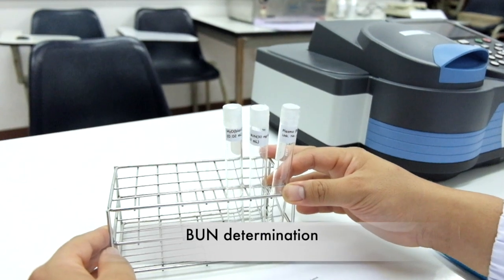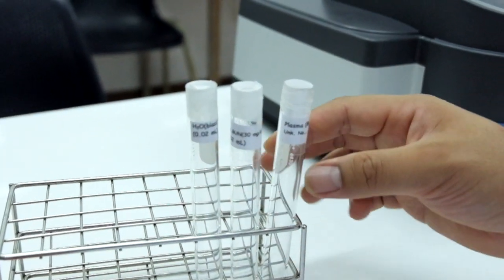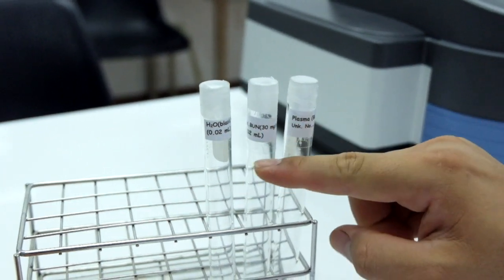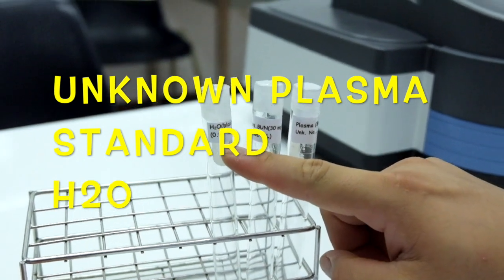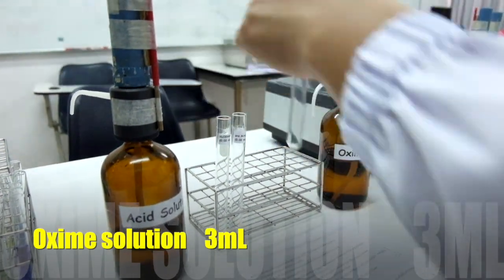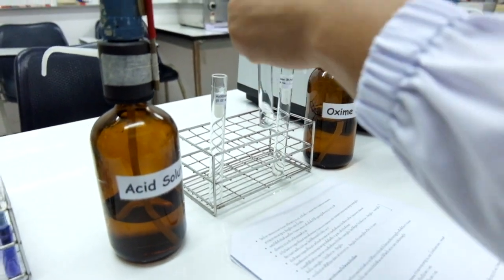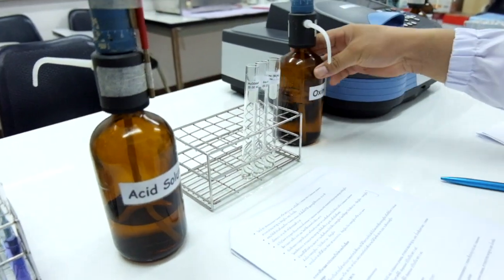BUN determination. For BUN analysis, you receive 3 test tubes containing 0.02 milliliters of unknown plasma, standard urea nitrogen, and water. Fill 3 milliliters of oxime solution into the tubes of the unknown plasma, the standard, and the water.